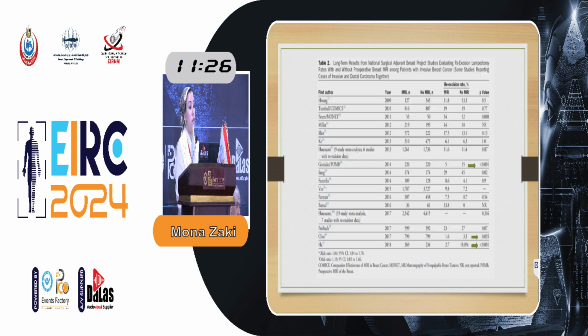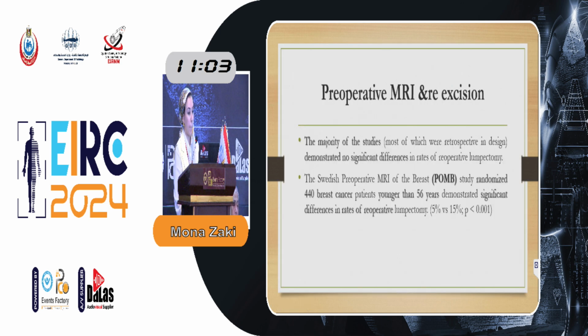These are different studies comparing re-excision rates in patients with breast cancer doing MRI preoperatively and not. Only 3 studies demonstrated significant reduction in re-excision rates when the patient did preoperative MRI. As I said, the majority of studies demonstrated no significant reduction in reoperation and re-excision rates.